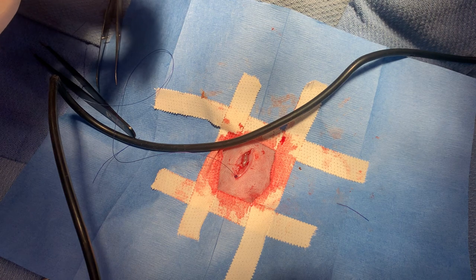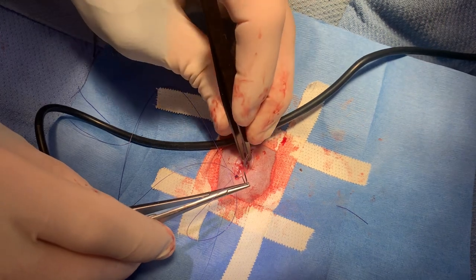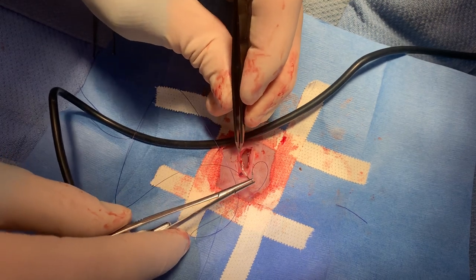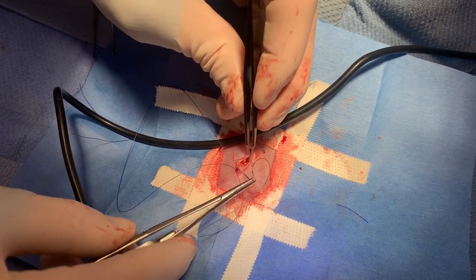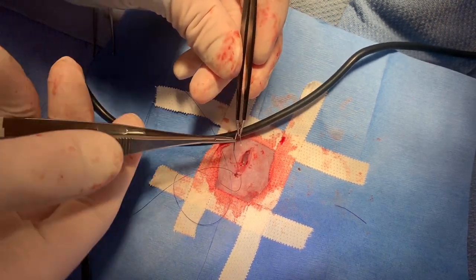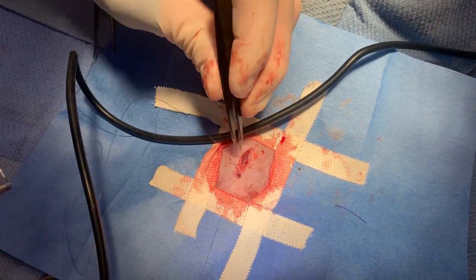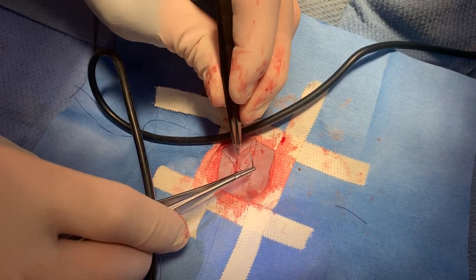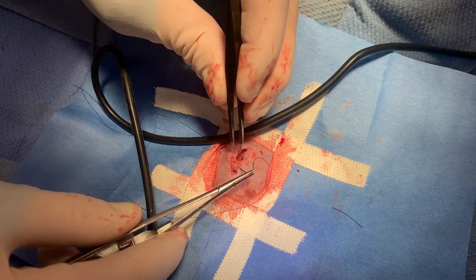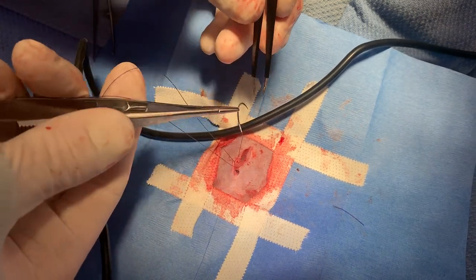Too big of a needle for them. Just those needle drivers, no good. Okay. For animals this small, would a taper be beneficial? Yeah, I'm using a taper just to not cut the tissue too much. Sorry, I didn't mean like recommending, I was just curious. No, yep, that was exactly my thoughts, and using a taper for exactly that reason. Don't want to slash the tissue.